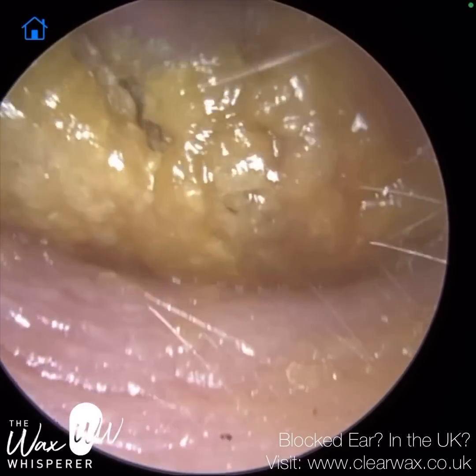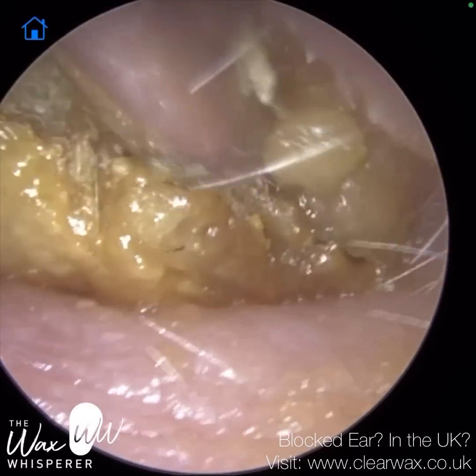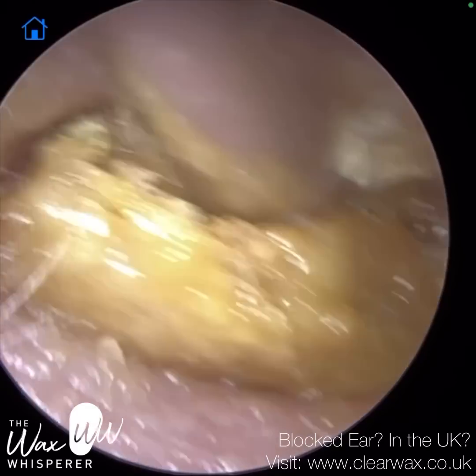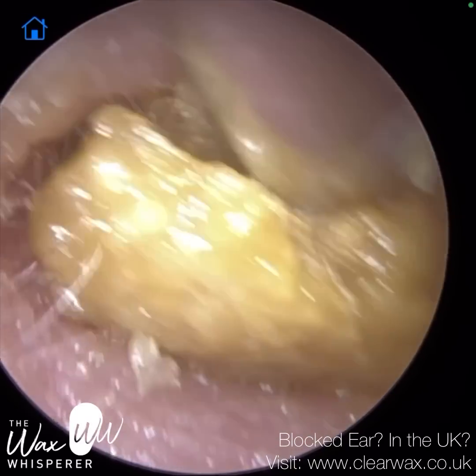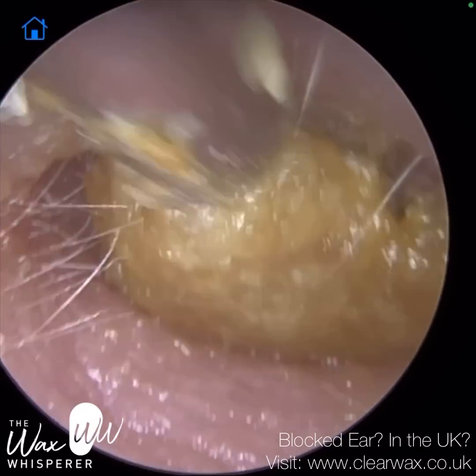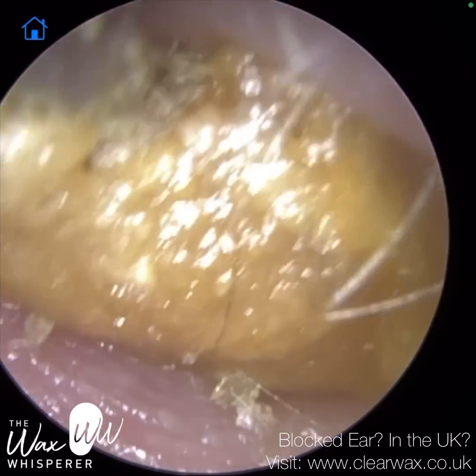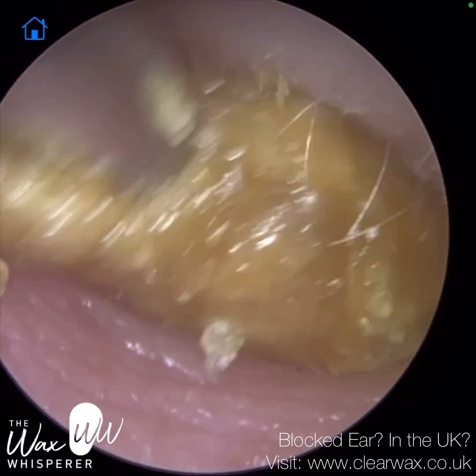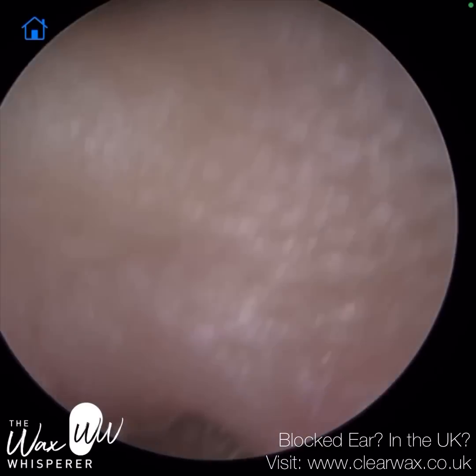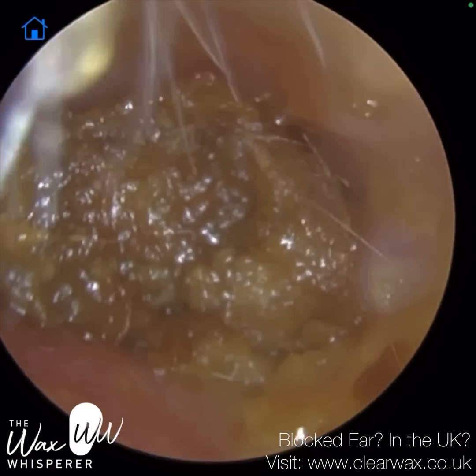If anyone doesn't know what the wax scope is, it's a slightly different device to the iClearScope that I developed, which is an endoscope. With an endoscope, we don't use a speculum. A speculum is a hollow, tapered, funnel-shaped object — if you've had your ears examined at the doctor's surgery, they attach that on the end of the ear torch, and it goes into the ear. It's designed to help stretch, straighten, and widen the ear canal and allow light to channel through into the ear, illuminating the inside. With an endoscope, you don't use a speculum.